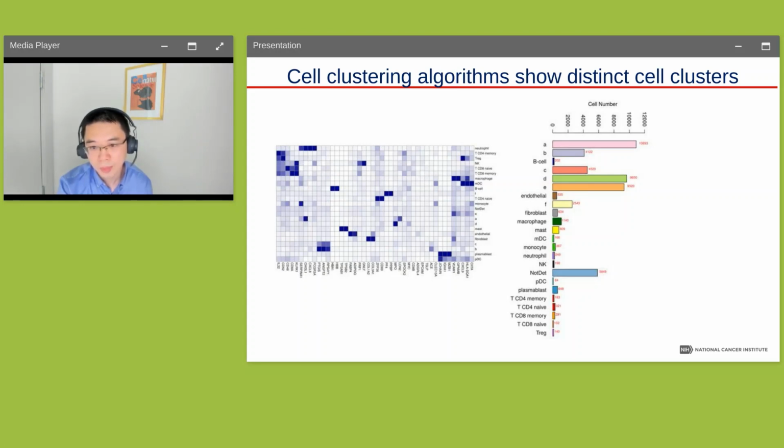So in general, with the DSP platform, we were able to see the dramatic difference in the T cells before and after the checkpoint treatment. Now with this new platform, we are able to zoom in to exactly single cell spatial resolution to look at how the T cells interact with the leukemia cells.